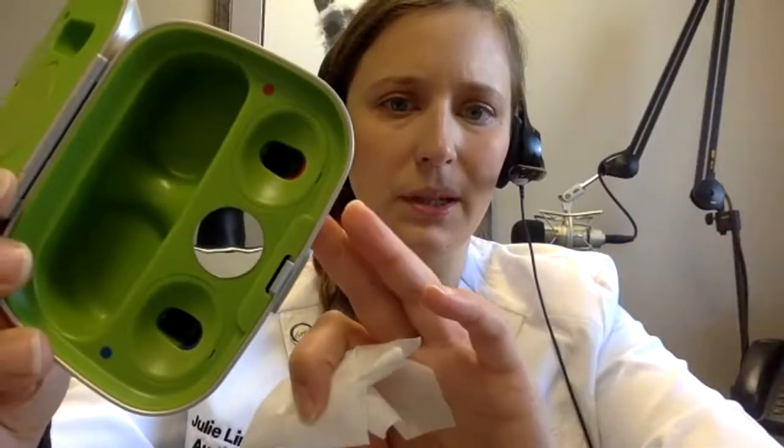If you have rechargeable, I see this a lot. At first, everything's working good, and then all of a sudden it stops working quite as well, or we're not getting as long of battery life. Sometimes the contacts actually in the charger itself could use cleaning out too. So again, the Q-tip usually helps. I've noticed it a lot with some of these really tighter contacts versus some looser ones, but you can do this on any brand of rechargeable hearing aid too.